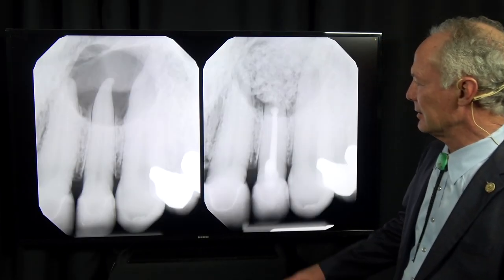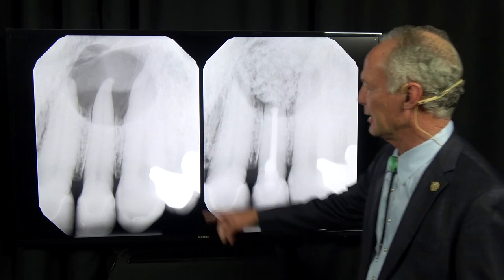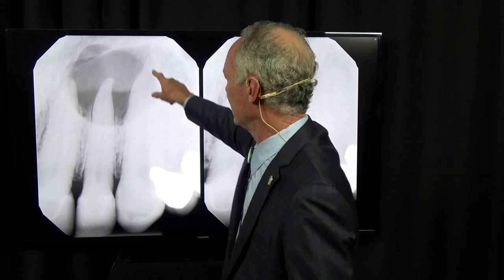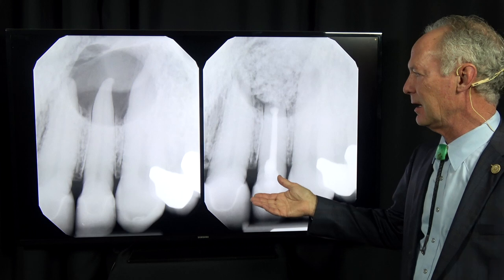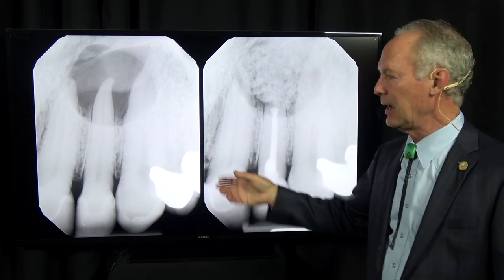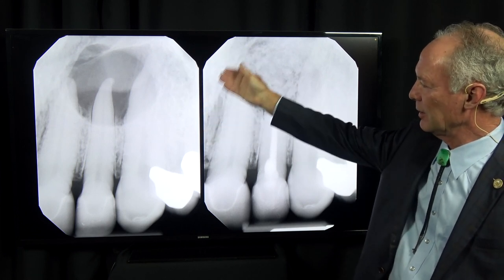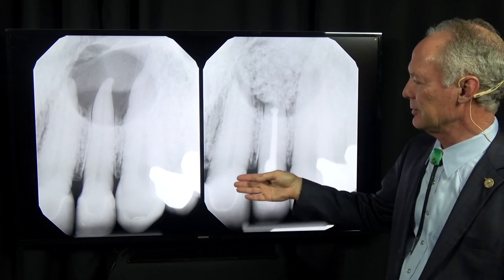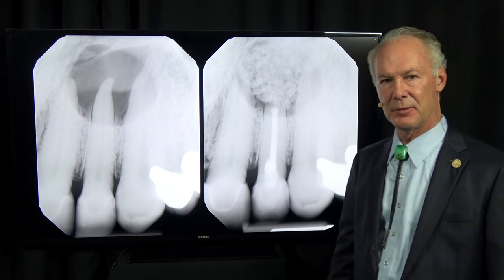This is a very interesting case involving a necrotic pulp on a lateral incisor and a huge granuloma. You can see this giant granuloma. I elected to do both endodontics and an apicoectomy and retrofill, and graft the granuloma site defect once I removed the granuloma, just because there was so much infection — I wasn't sure that endodontics alone would solve the problem.